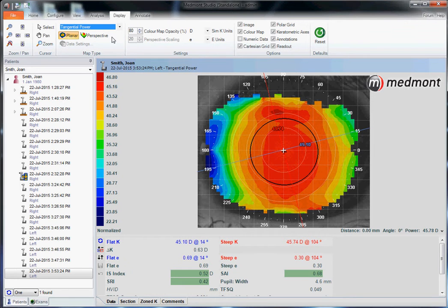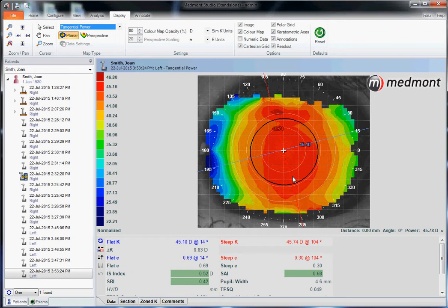Tangential is the best way to interpret the shape of the eye. We can look at the green, yellow, and orange contours and how they appear to be pulled inferior and slightly temporal. So a rigid contact lens placed on this patient's eye is most likely going to want to de-center slightly temporal and slightly inferior. Tangential is also very sensitive to finite points of curvature change, such as any molding done to the eye with a contact lens.